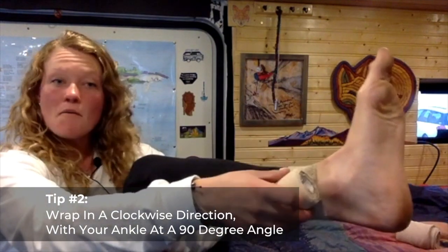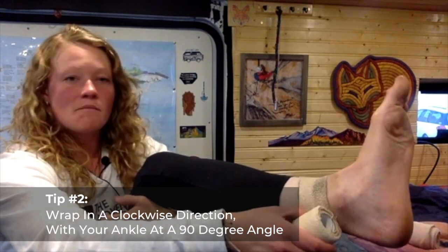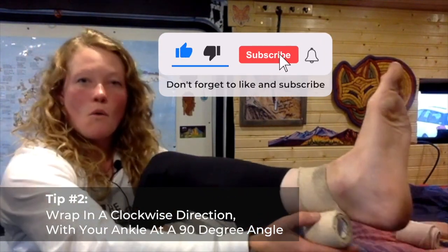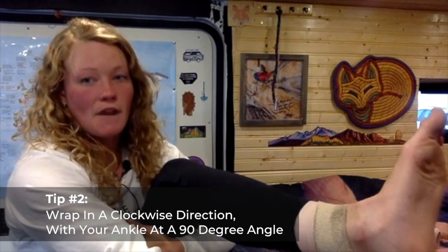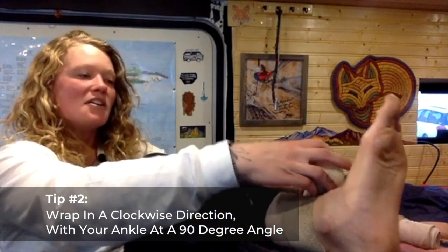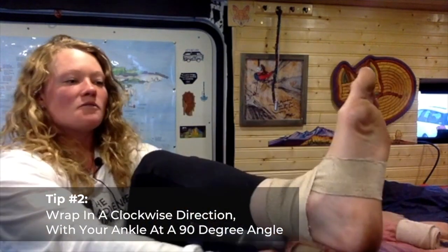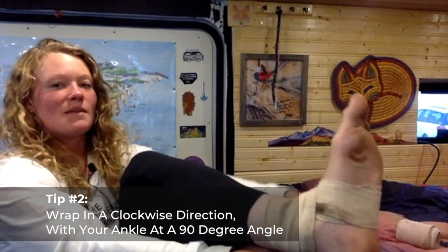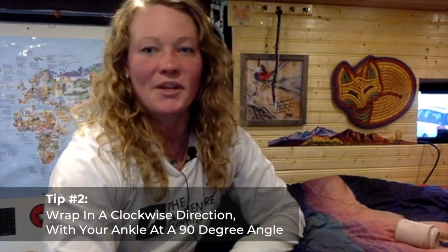While there are various methods for wrapping a sprained ankle, the easiest one to learn and my go-to in the backcountry — one that works well and provides support whether you've inverted or everted your ankle, with inversions being the most common kind of ankle sprain — is the figure eight wrap. You're going to wrap it beneath your foot and come around in a figure eight shape, repeating this until you run out of your ace bandage or compression tape. That first wrap at the top of your foot serves as a guiding point.